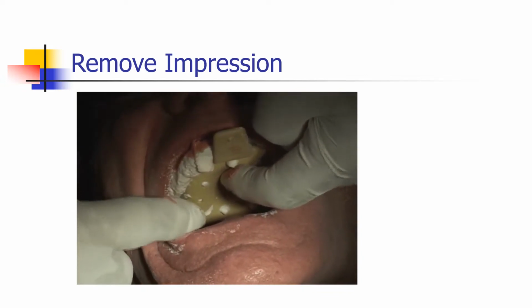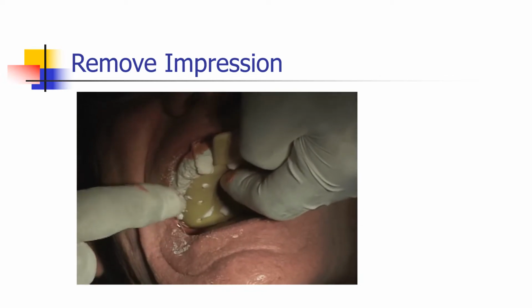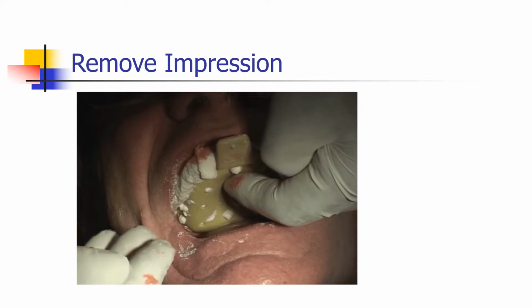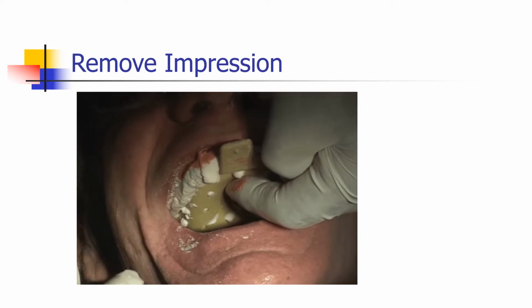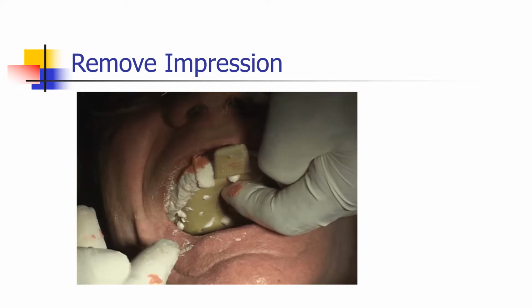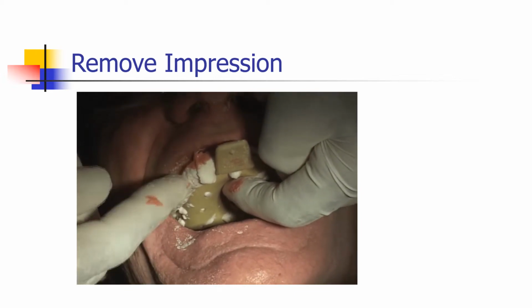And Mr. Gray actually is not a gagger, but for gaggers, we just tell the patient to breathe through their nose, and the tongue comes up in the back and blocks the material from going down the throat. And say, just breathe through your nose and this will be comfortable. And I've rarely ever had anybody gag on this material.